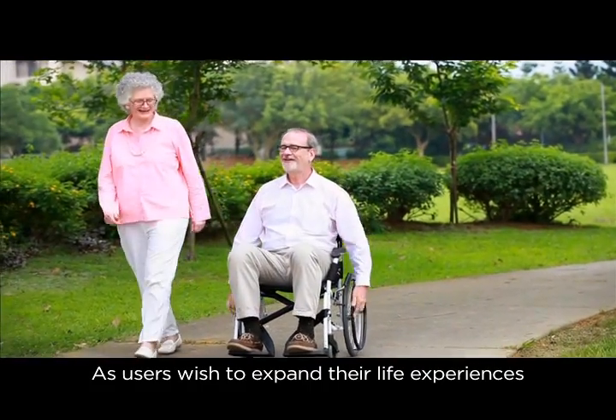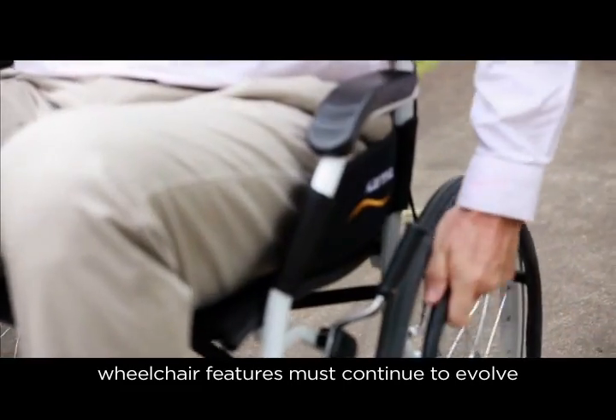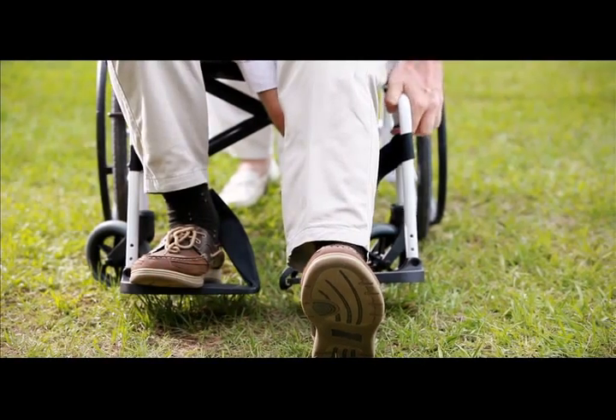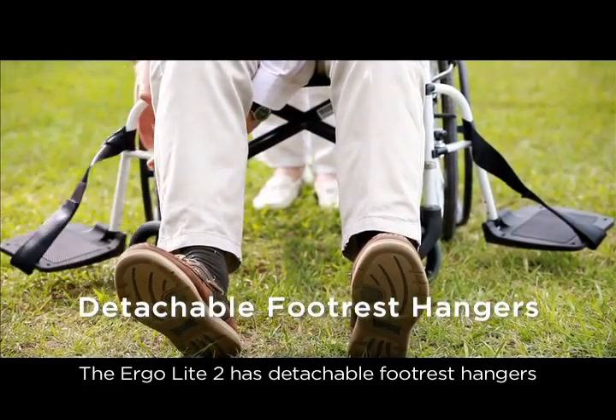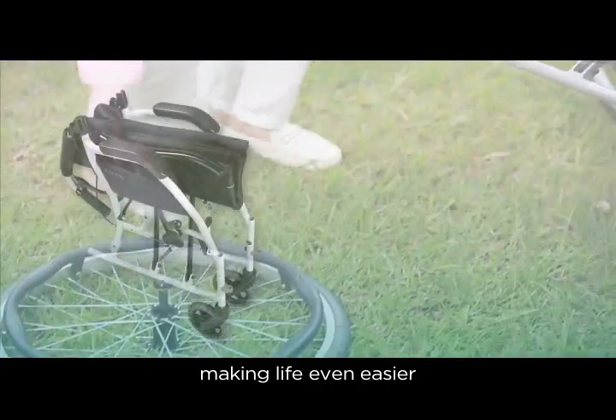As users wish to expand their life experiences, wheelchair features must continue to evolve. The Ergolite, too, has detachable footrest hangers with quick-release wheels, making life even easier.